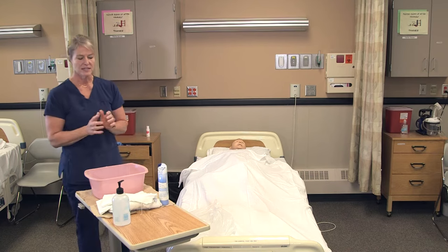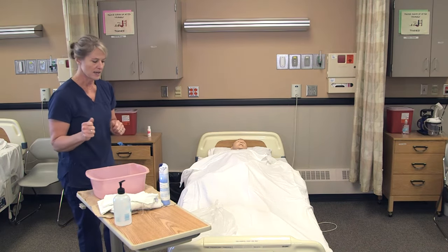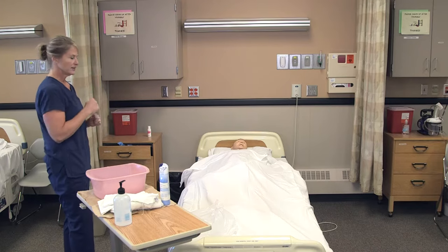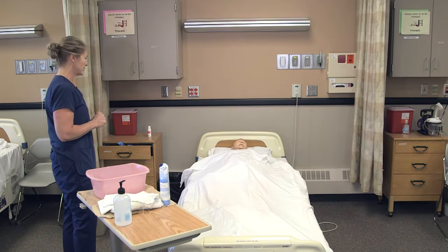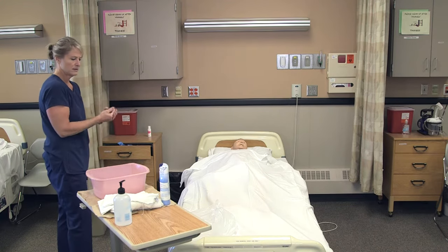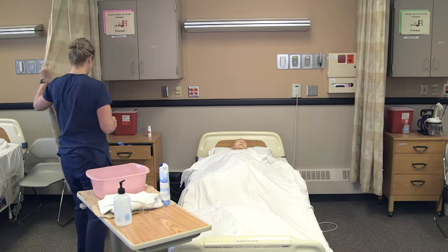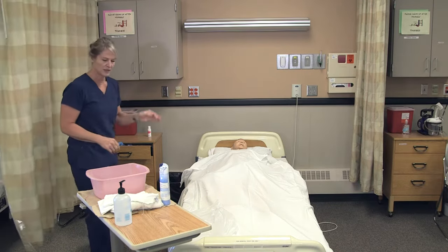For catheter care, I would wash my hands and get two washcloths and a hand towel from the linen closet. Then I would go to the resident room and knock on the door: 'Good morning Lee, I'm Myra, I'm here to do your catheter care, is that okay?' I'm going to wash my hands again and provide for privacy.